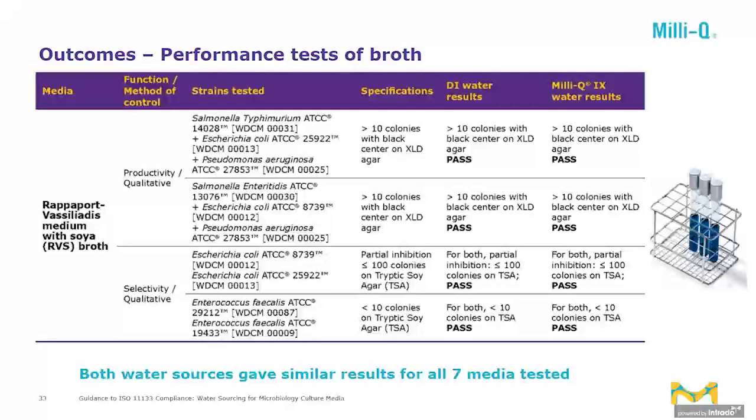Barbara, does the standard cover culture media for other usages besides food and beverage, like pharmaceutical applications? Yes and no, I have to say. Thanks again for this question. The standard covers culture media mostly for food and beverage and water testing, microbiological testing, but the testing methods can be applied also for other culture media in beverages, and in pharmaceutical culture media, for example.